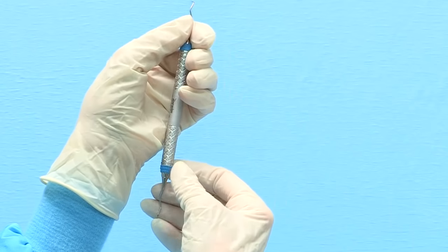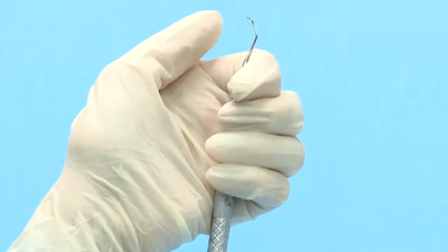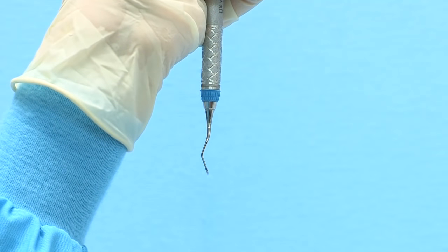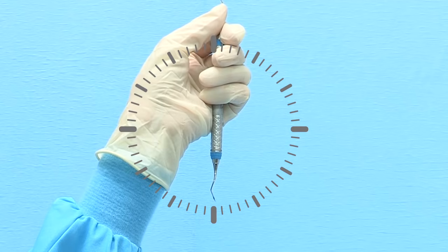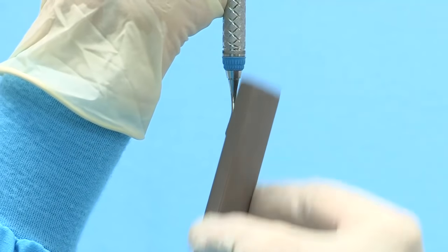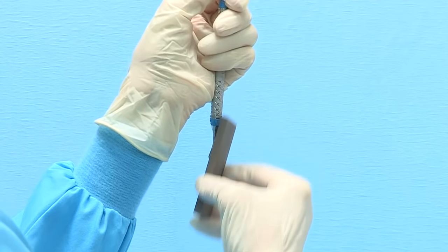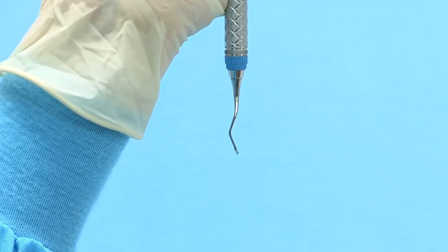To sharpen the even-numbered end of the Gracie curette, hold the instrument vertically in your non-dominant hand with the toe pointed away from you. Use a firm palm grasp and brace the top shank with your thumb. The cutting edge to be sharpened will be on the right side of the blade. Focus only on the terminal shank, the section between the blade and the last bend in the shank. Tilt the terminal shank to 3 minutes before 12 o'clock. Position the stone against the right lateral surface at 12 o'clock and tilt the top of the stone to 3 minutes past 12 o'clock. Initiate sharpening in a consistent up and down motion from heel to middle to toe third. The blade of a Gracie curette is straight — do not rotate the stone as you move from heel to toe; instead, sharpen in a straight line to preserve the original blade design.